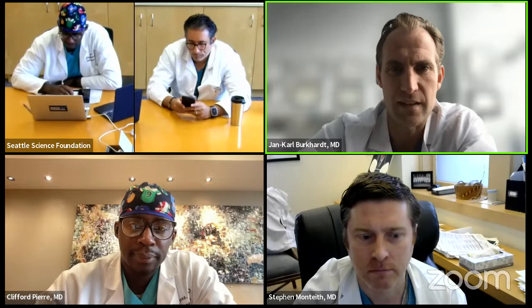Yeah, so for all our intraop angios, for the radial cocktail, if you go wrist for intraop, we usually don't give the heparin, as you mentioned. We connect our sheath to an A-line for anesthesia, so there's no flush line on it. You can use that as an A-line, and that's useful for the catheters. When we do our angio, I'm trained to have a flush line on all my catheters. So there is heparin in there, and I think that's fine.